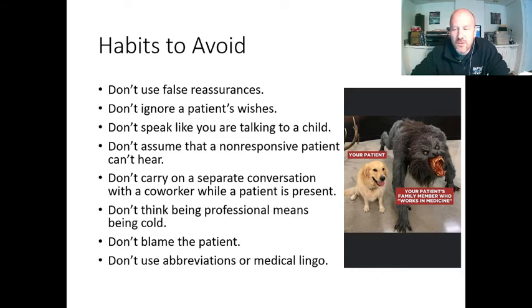Do your best to give your patient choices as much as possible. Do you want a pillow, yes or no? Do you want a pillow underneath your knees? Would you like a blanket? When at all possible, give them a choice. Don't assume that if a patient's unresponsive that they can't hear you. They probably can.